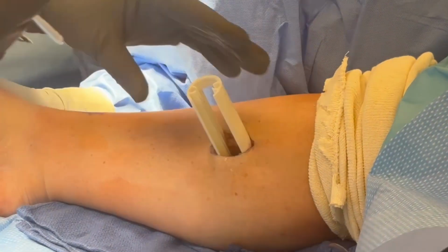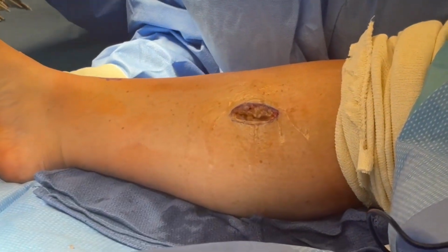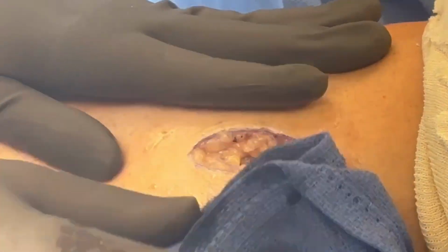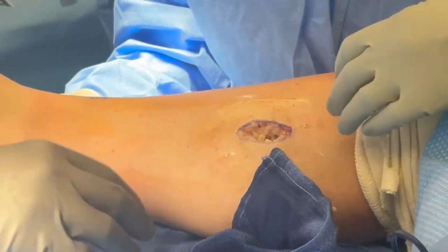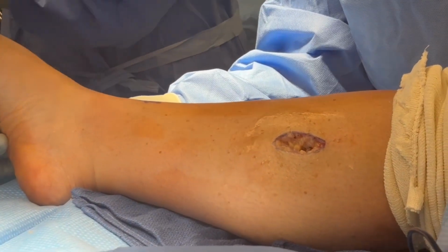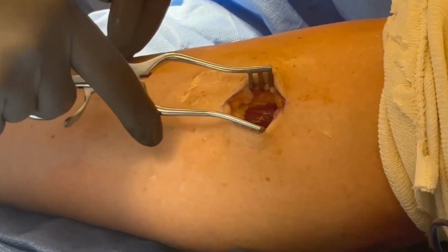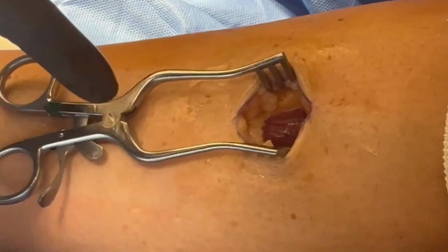Now I like to flush or irrigate the area with Marcaine with epinephrine. It helps with hemostasis. It also helps to provide postoperative anesthesia, and we're going to remove the system, turn the light off, and then take out the cannula. I usually put a towel down because a lot of that flush is going to work its way out when you pull out the cannula.